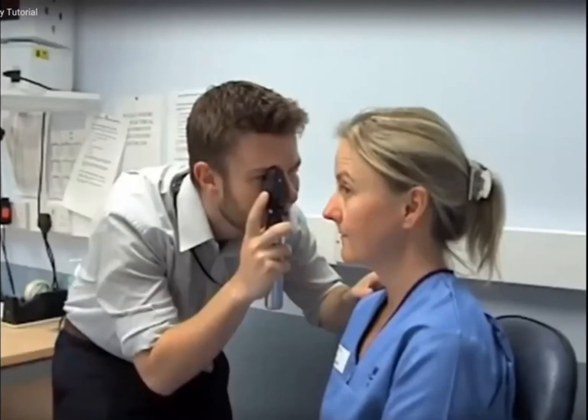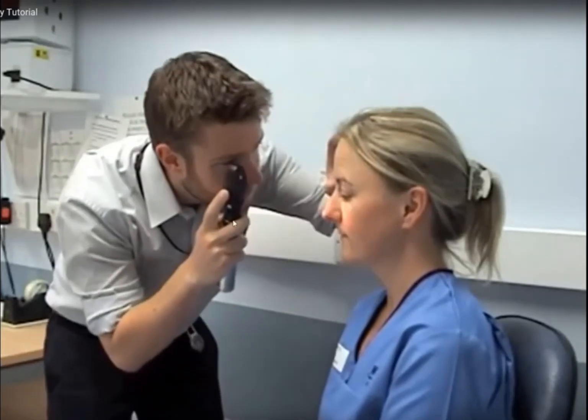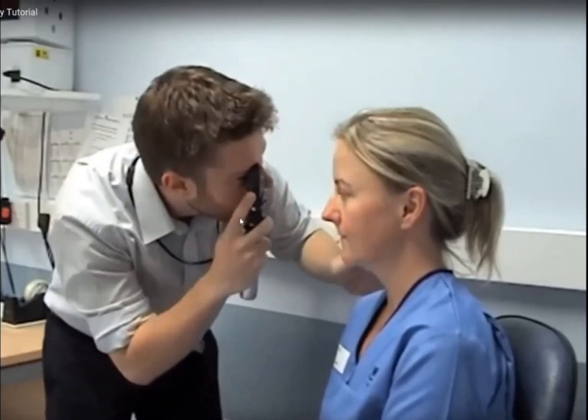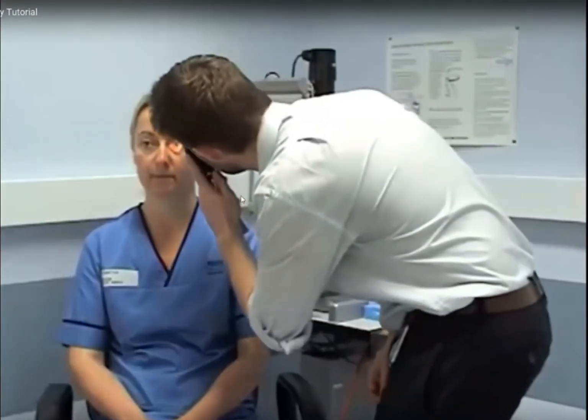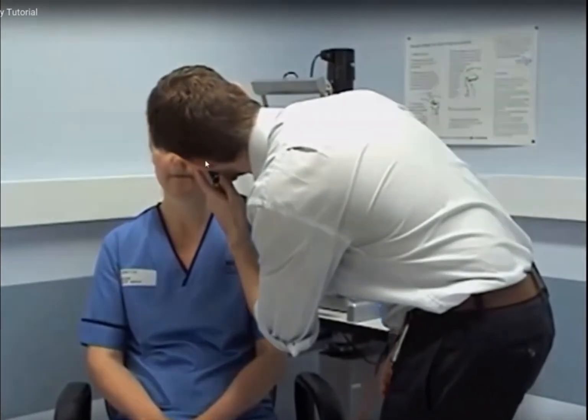So I hope you can see my video. Right, so that helps the doctor to be able to see the back of the eye.